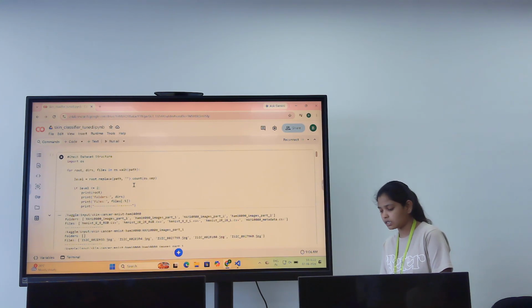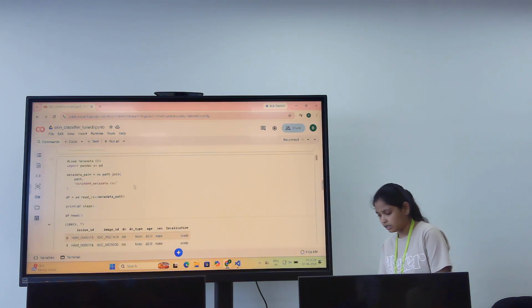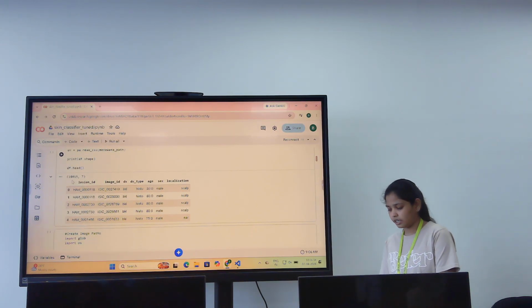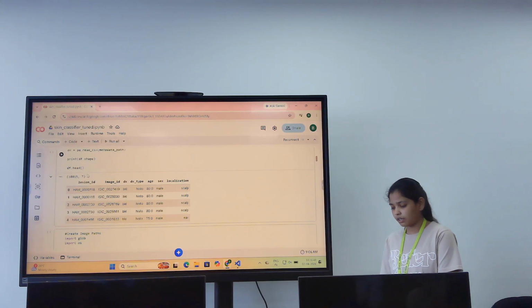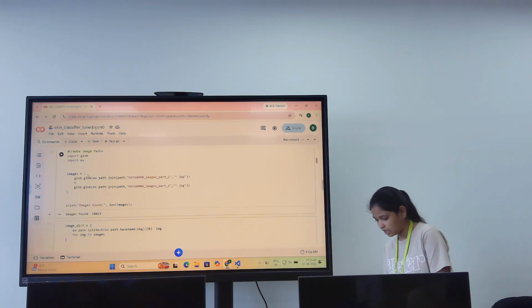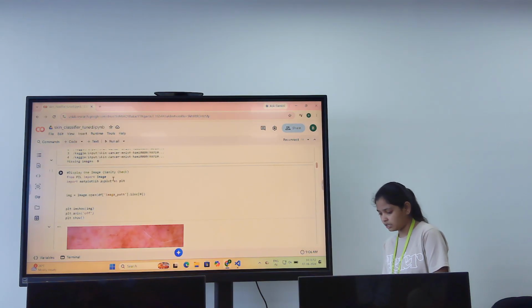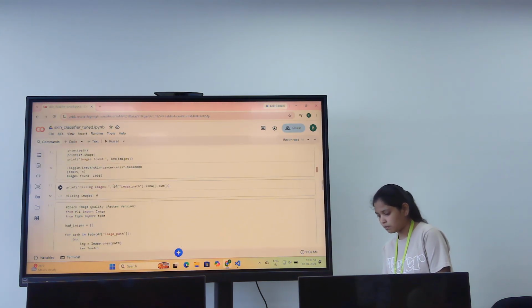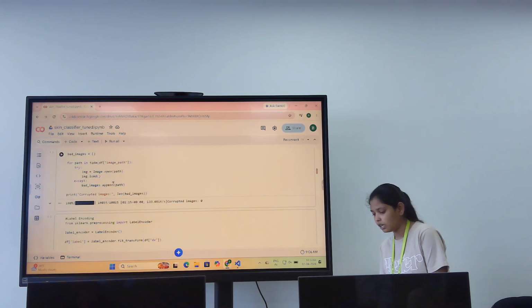Before training, I analyze the dataset. Here I check the dataset structure and information. The dataset contains 10,015 images, classified under 7 categories. Next, I create the image path, and for a sanity check, I display one image from the dataset. Next, I check for missing or corrupted images in the dataset.